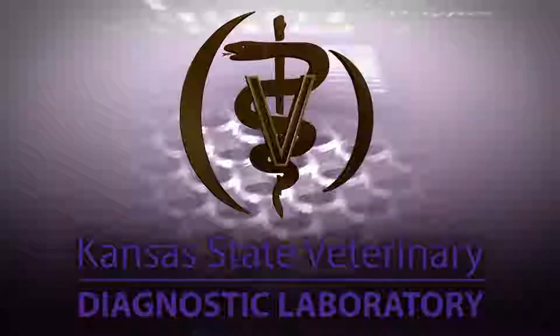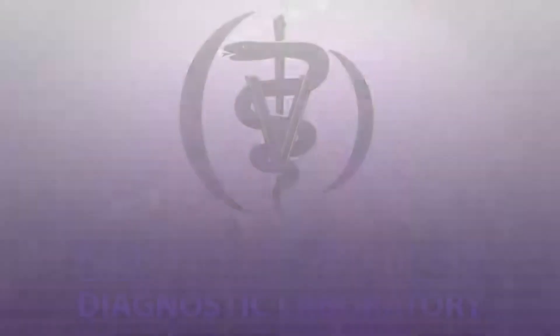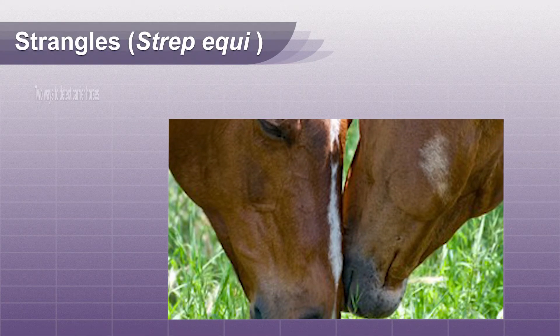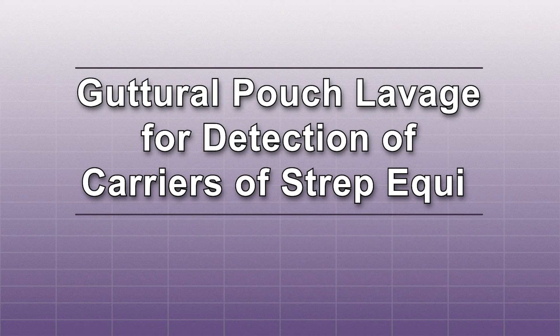Hello, and welcome to the Kansas State Veterinary Diagnostic Lab YouTube channel. Strangles, or strep equi, is a frustrating disease that can be difficult to prevent. We now understand that strangles is likely spread from horse to horse by carrier horses. Recommended ways to detect carrier horses is either by guttural pouch lavage or nasopharyngeal lavage. This video will show the proper technique for a guttural pouch lavage used for detection of carriers of strep equi.